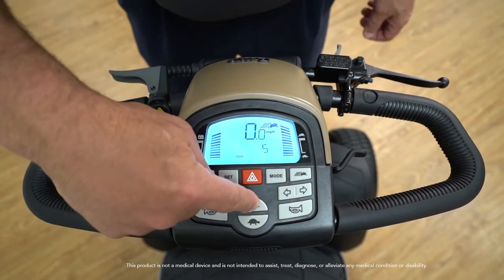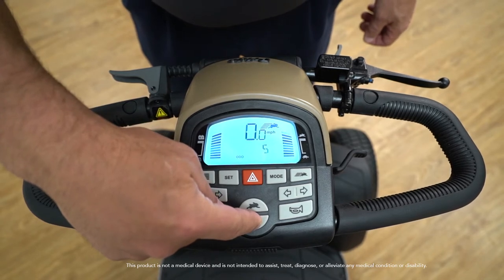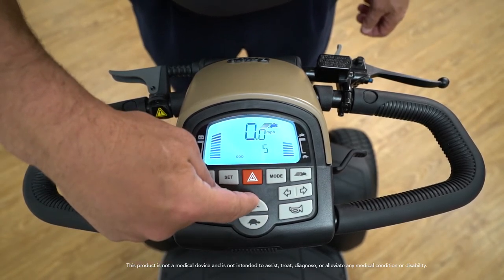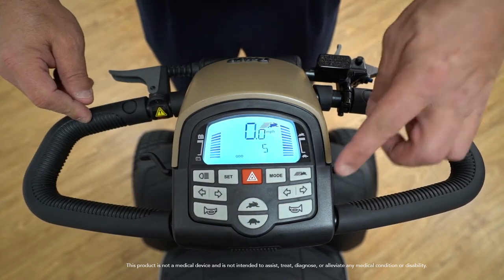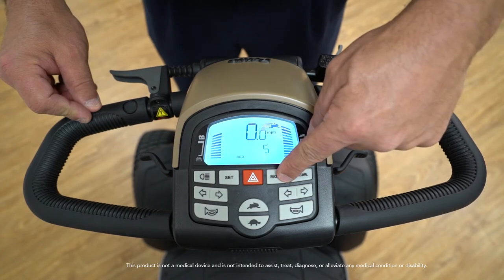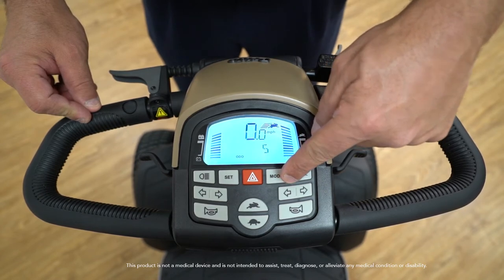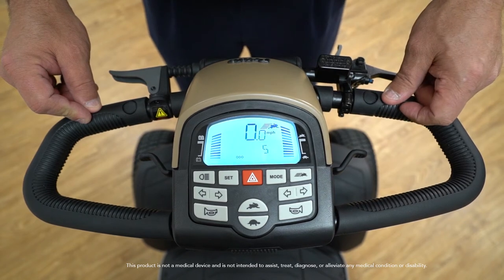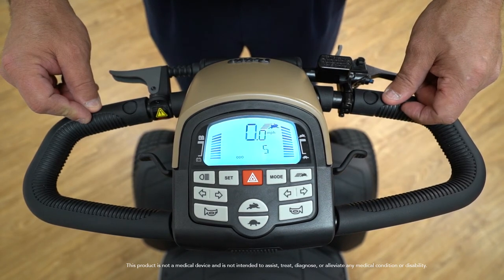There is also a hazard button which will activate flashers both on the front and back of the scooter. The Wrangler's speed control is displayed with a rabbit and tortoise button. Simply hold down the tortoise button to slow the speed or press the rabbit button to set the scooter to a faster speed, up to 11 miles per hour. The mode button allows you to see other features on the display such as temperature readings, odometer readings, and a trip meter. This will allow you to monitor your range per charge, which is about 29.4 miles.